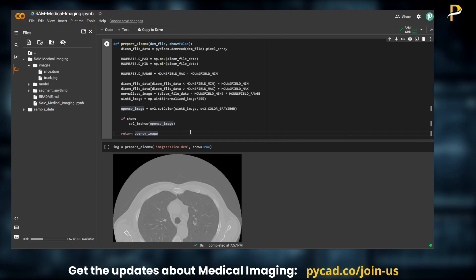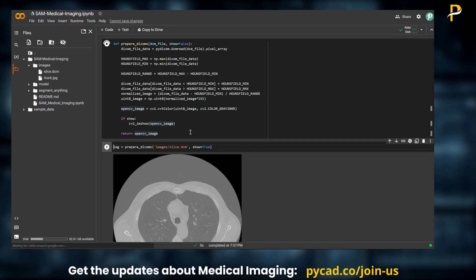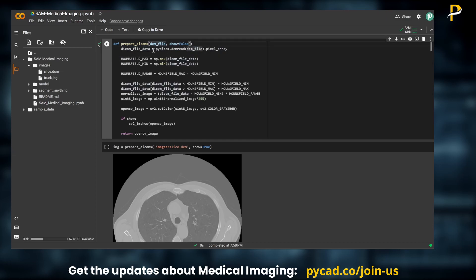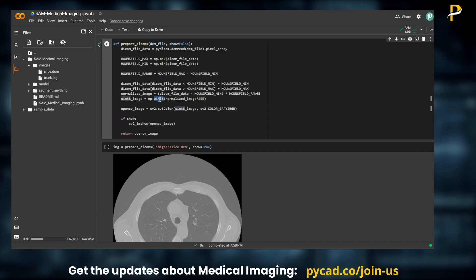For medical imaging purposes, we'll use DICOMs, NIfTI, or anything like that. For this example I am taking only one DICOM, but if you want to use NIfTI or something else you can always adapt the code. The function prepare_dicom takes the path to the DICOM, reads it, normalizes it, and converts it to unsigned integer 8-bit. Since the values are normalized between zero and one, we multiply by 255 to get values between zero and 255.